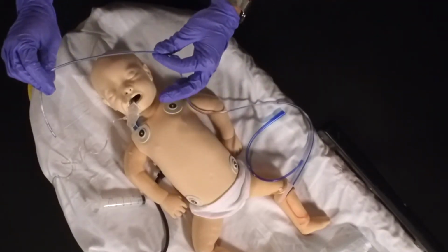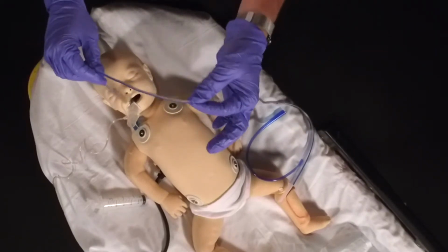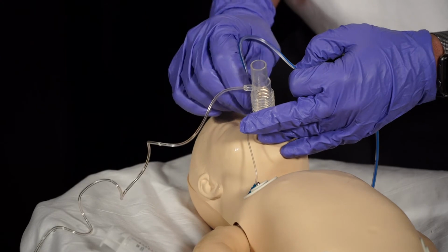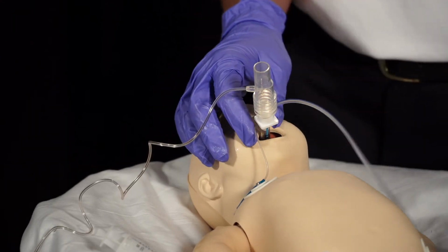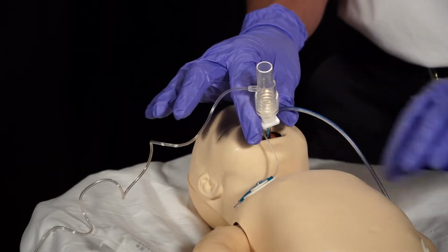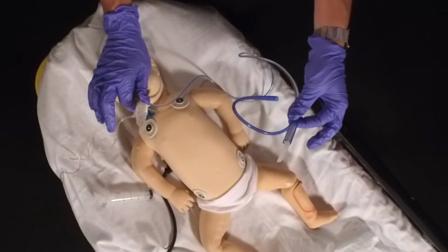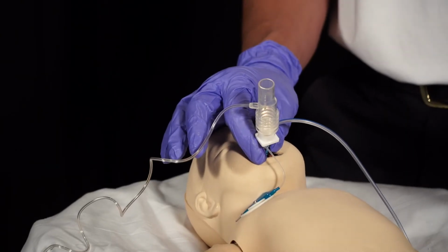So after we've lubricated the King Airway as well as the gastric tube, and have it to our desired depth, we want to insert it down the King Airway. You're going to just feed it down the back gastric access lumen until it gets to the appropriate depth. After it gets to the appropriate depth, you could put a little piece of tape on the King Airway to secure it. At this time, you could also use the endolock or a piece of tape to secure the tube to make sure that it doesn't move during transport.